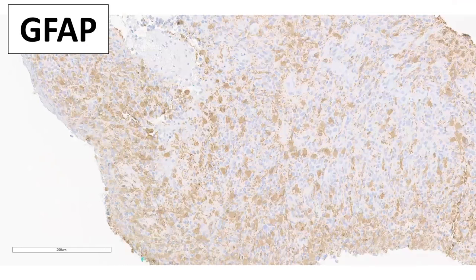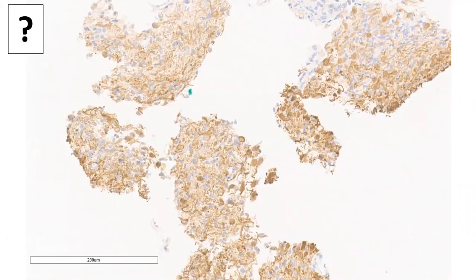Okay. So this is the GFAP on this case. And you can see it looks virtually identical, right? Highlighting the gemistocytes. This is not GFAP, right? Because I wouldn't do that. If it's like test taking strategy, you know what I'm saying? There's no way in this conference that I'm going to show you a GFAP and let's talk about GFAP. Probably not, right? Because that's 101 and this conference is 401, right? So you've got to hit the ground with your feet moving in this conference, right?